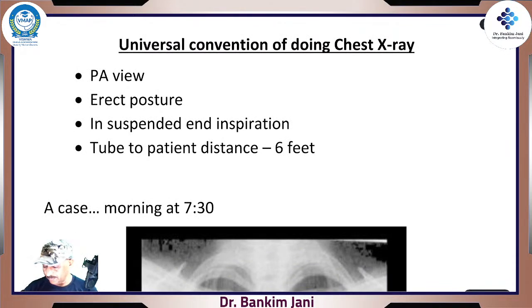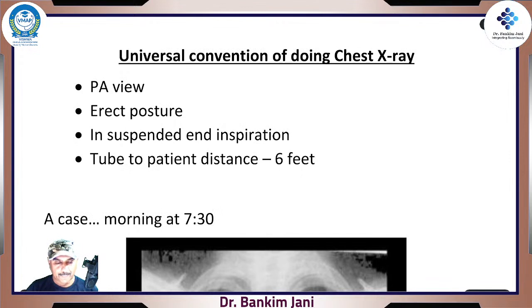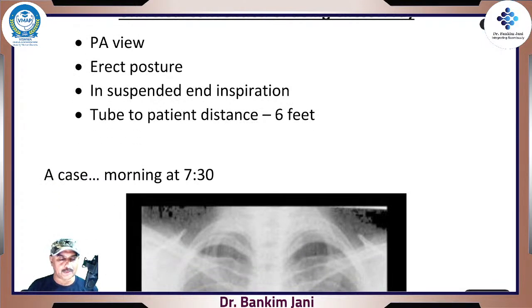Some universal convention. It is necessary when you take the X-ray, you need to remember. When one of the questions was asked, at that point I said yes, we'll discuss it when we'll be taking the X-rays. Universal convention means these are the rules which you must follow. One is for the PA view, commonest erect posture, so the patient must be standing, in suspended inspiration. Why so?